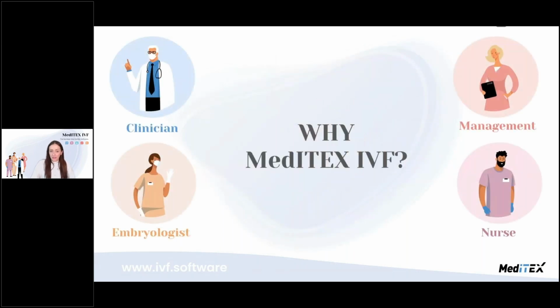So now we talked a little bit about the roles, about what MedITEX IVF covers. Of course, there's way more to discover in MedITEX IVF. There's way more to see. And now you may ask yourself, why MedITEX IVF? Why is MedITEX IVF the right fertility software for my clinic specifically?